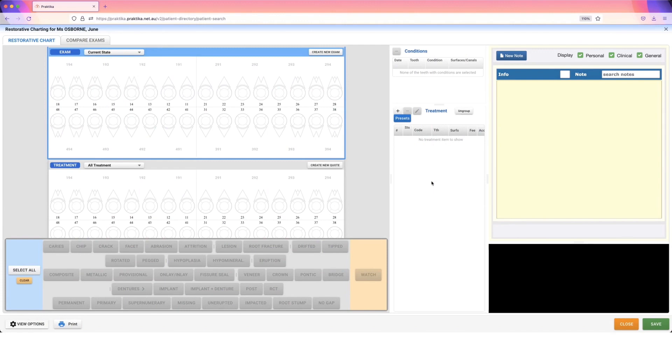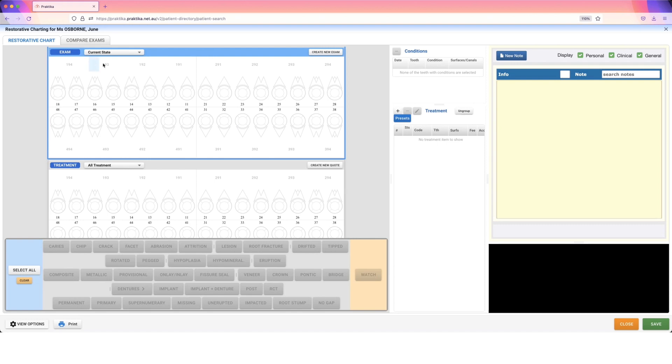This video is going to show you how you can do your baseline charting or your existing condition charting. The first thing that you'll need to make sure you do is select the correct charting up here. I am currently selected on my current state exam chart, which gives me the appropriate options down the bottom of the screen.